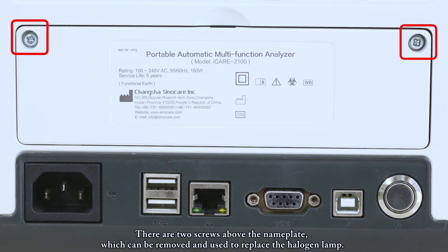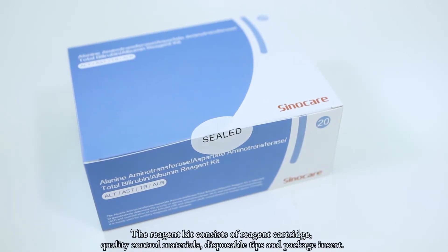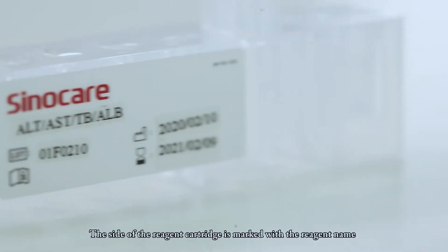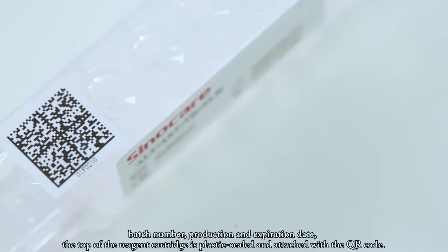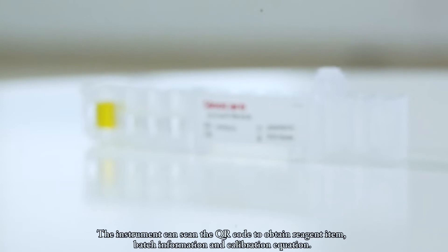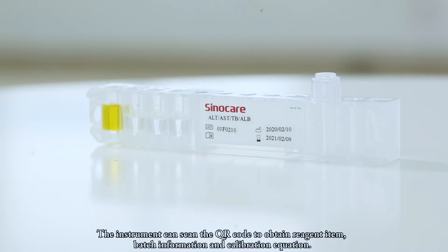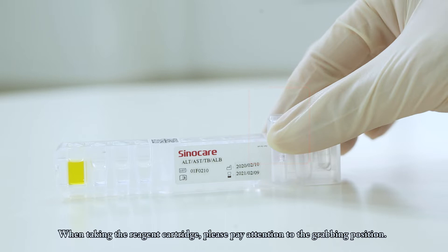There are two screws above the nameplate, which can be removed to replace the halogen lamp. The reagent kit consists of reagent cartridge, quality control materials, disposable tips, and package insert. The side of the reagent cartridge is marked with the reagent name, batch number, production date, and expiration date. The top of the reagent cartridge is plastic sealed and attached with a QR code, which the instrument can scan to obtain reagent item, batch information, and calibration equation. When taking the reagent cartridge, please pay attention to the grabbing position.